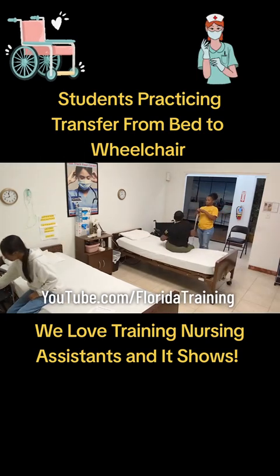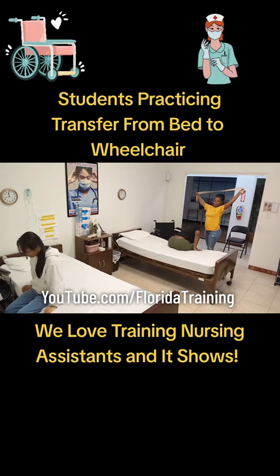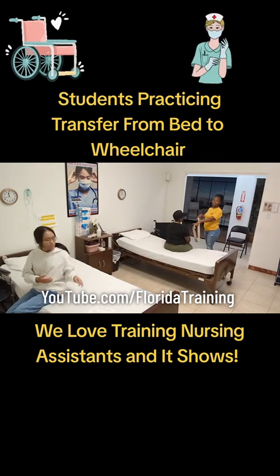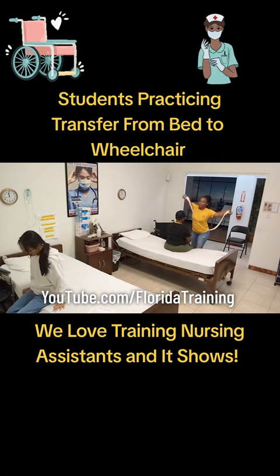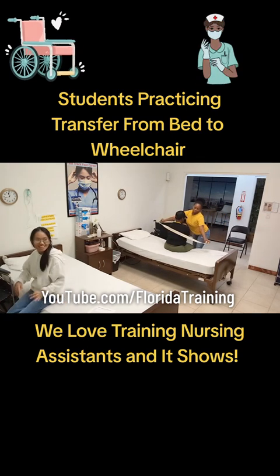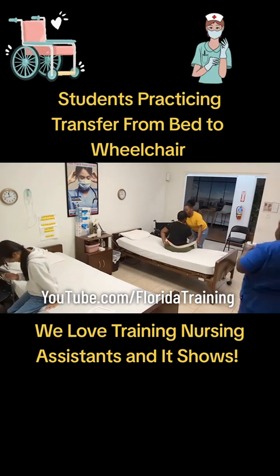You have to put your patient's shoes on. Stop being lazy. That's fine — she said we really have to put the shoe on. I'm proud of you, Rochelle. She has to put your shoes on. Imagine her taking care of your grandmama if she wouldn't put your grandmama's shoes on.